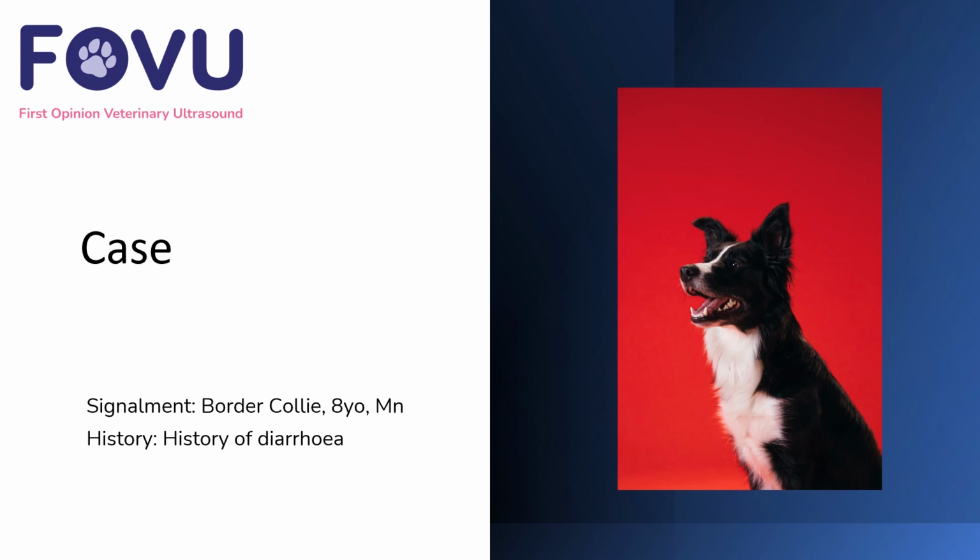Welcome to this first opinion veterinary ultrasound case. This case was a border collie who was 8 years old, male-neutered, with a history of diarrhea.